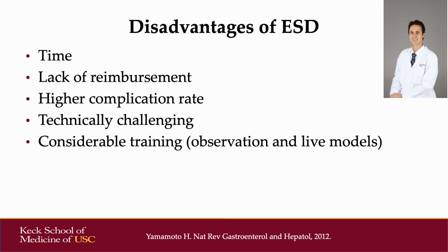However, there are also several disadvantages of ESD. ESD is a procedure that can take a considerable amount of time. In the United States, there is still a lack of reimbursement for ESD. The complication rate tends to be higher compared to EMR. It is technically very challenging and also involves considerable training, both observation of procedures as well as performance of procedures on live animal models.